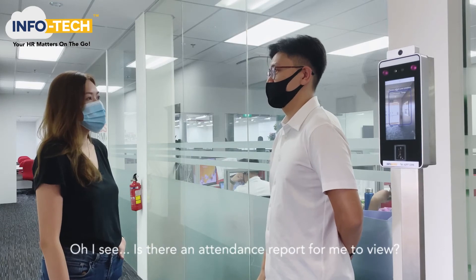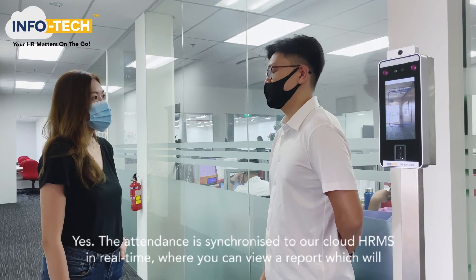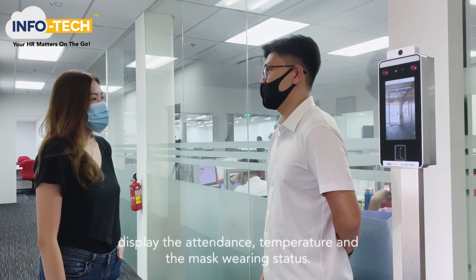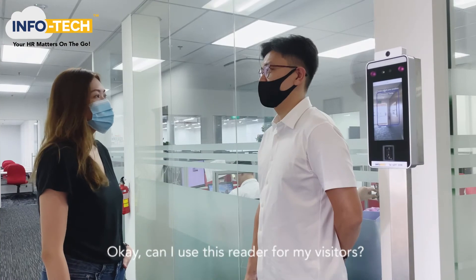I see. Is there an attendance report for me to view? Yes. The attendance is synchronised to our cloud HRMS in real time, where you can view a report which will display the attendance, temperature and the mask wearing status.